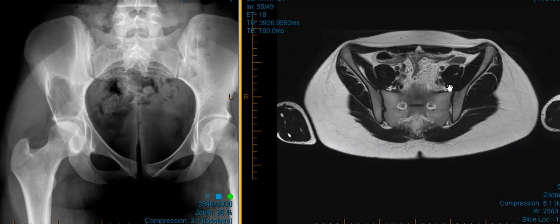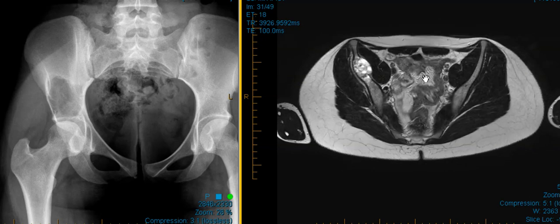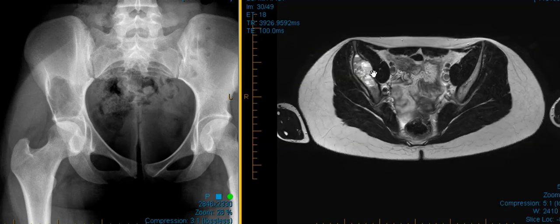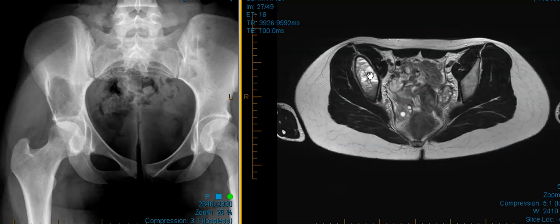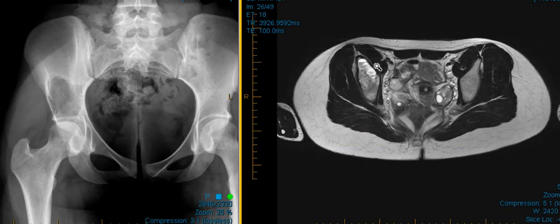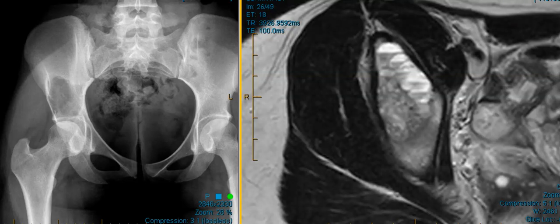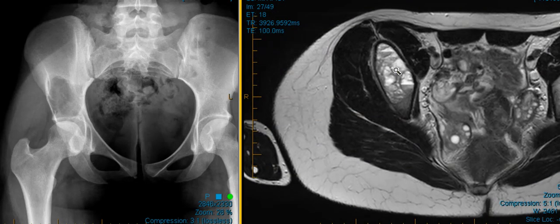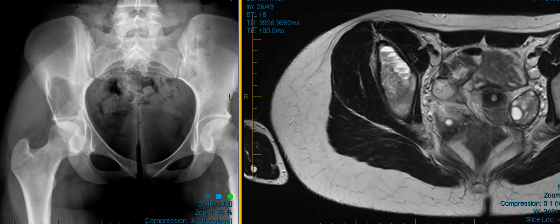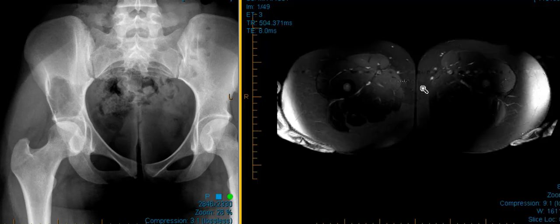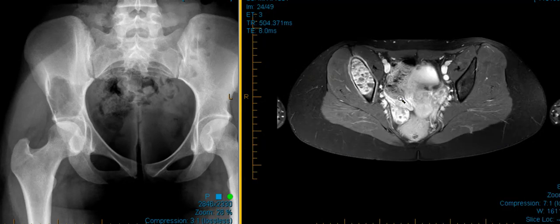Now we're going to put up another view — this is a view where fluid looks bright. And on this view we see that these are little fluid pockets all through this, lots of little fluid pockets. We also see one other finding here: little horizontal bands like a glass filled with fluid. So these are what we call fluid-fluid levels. We know there are cystic components and other components of a different shade that are blood products — complex cysts with some blood products causing these fluid-fluid levels, and these are characteristics of a benign bone lesion called an aneurysmal bone cyst.